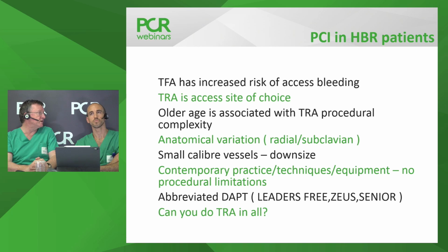But I think there's no doubt that when a patient comes into my cath lab who is over 85, I always say stop. Go to the left radial rather than the right radial, because anatomical variation in the forearm is less frequent in the left arm, and subclavian tortuosity, some calcification, and you have some problem to access. I totally agree with you. So selective use of left radial access is an important way of managing anatomical variation in the older patient group.